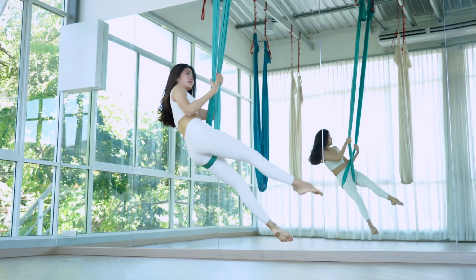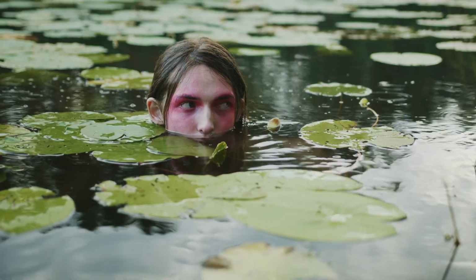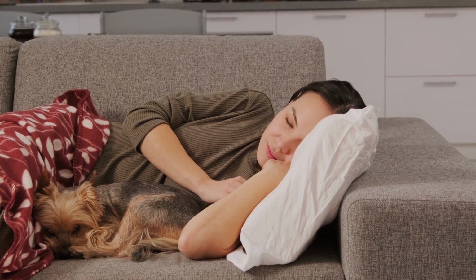But you can do the same things that you do with tampons with both of these products. You can do gymnastics, you can go swimming, you can sleep in them. There are things you can do with a disc you can't do with a cup, specifically penetrative intercourse. But other than that, they're really the same in terms of what you can accomplish while wearing them. Their benefits are also very much the same. You can wear each, a cup or disc, for up to 12 hours at a time safely. So you can put it in the morning, go the whole day, take it out at night and wash it.